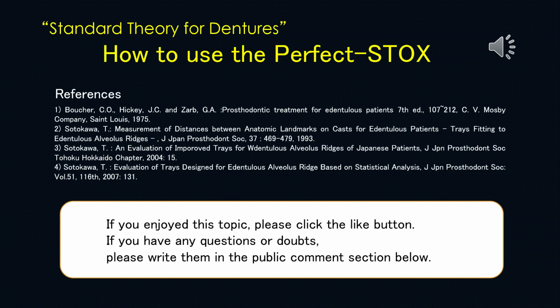Standard theory for dentures. How to use the perfect STOX is now complete.